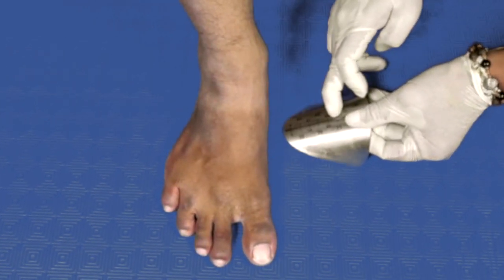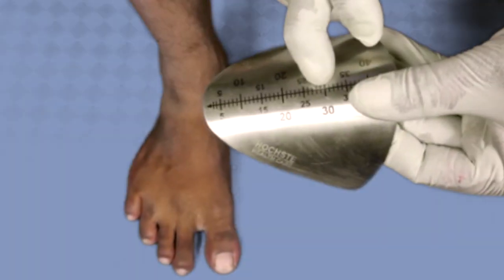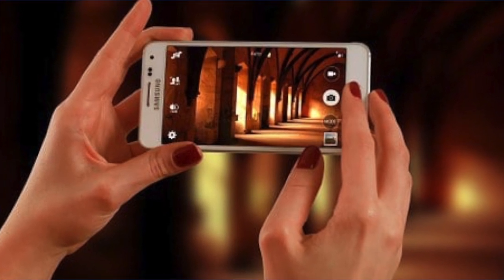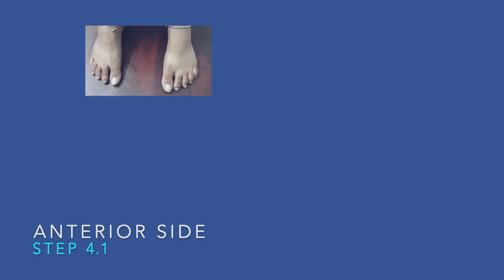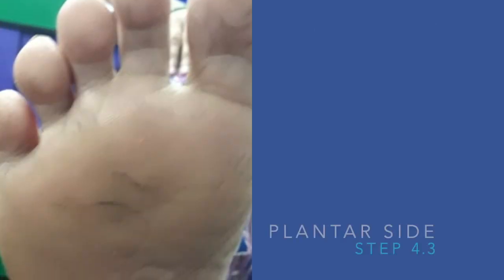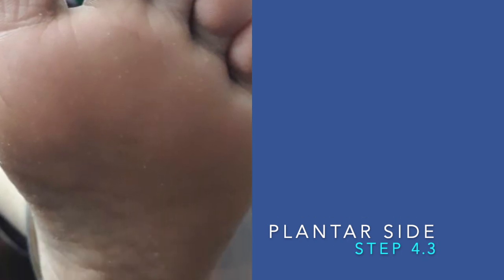We have to repeat the measurements for the other leg also. We have come to the final step of the whole process. Use your mobile and take photographs of the patient's foot from the anterior side, posterior side, and also the plantar side, and share it in the respective WhatsApp group.